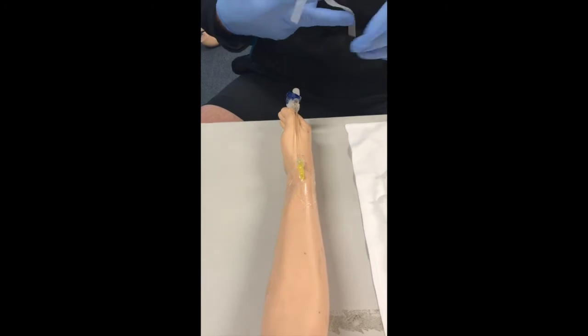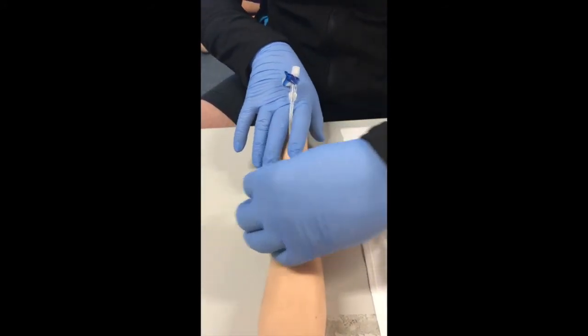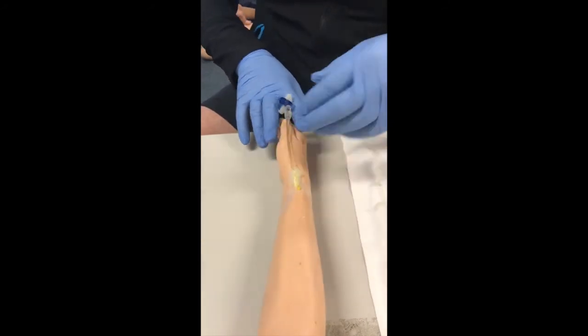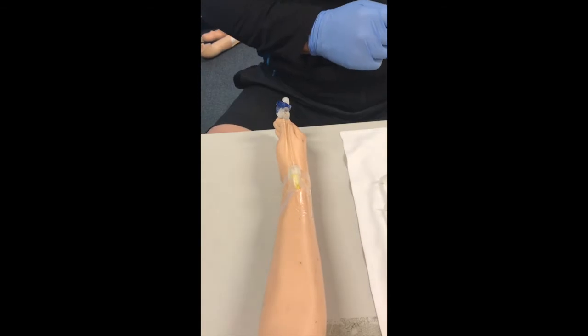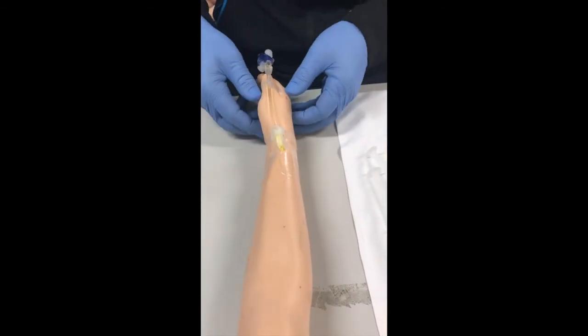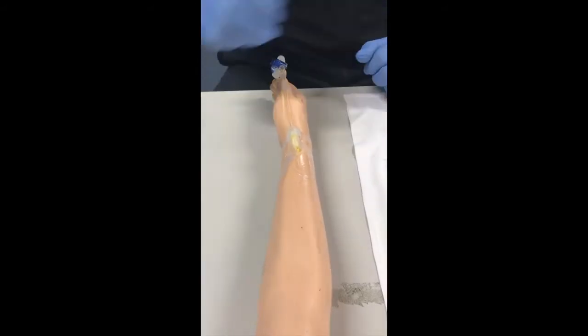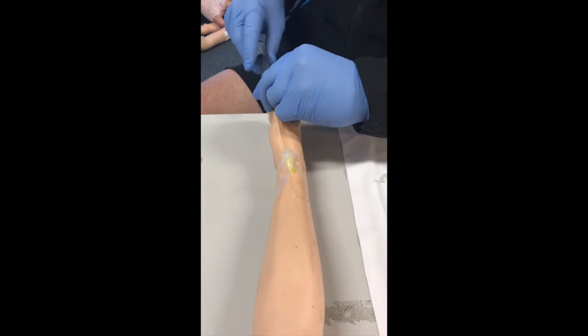To secure the cannula and the 3-way extension tubing, I place some tape underneath the tubing and fold it back over the cannula. Next I place some tubing over the hub of the cannula and then further to the 3-way extension tubing to further secure the cannula into place. Then I flush the cannula with 2 to 5 ml of normal saline.